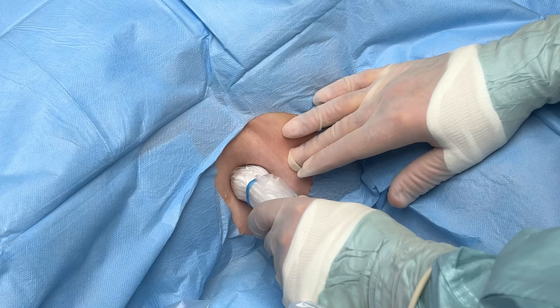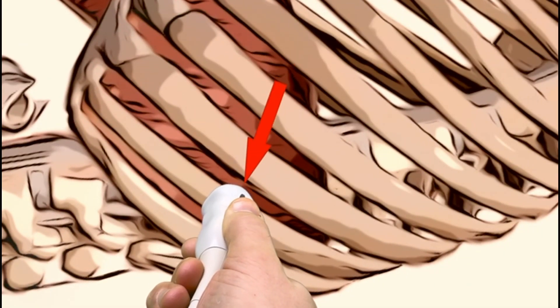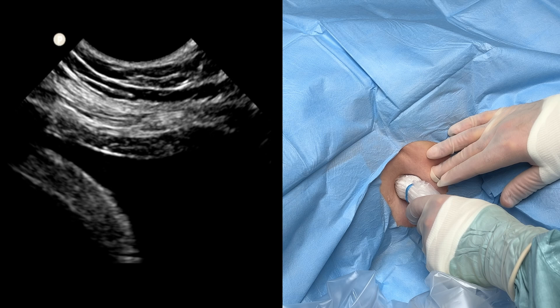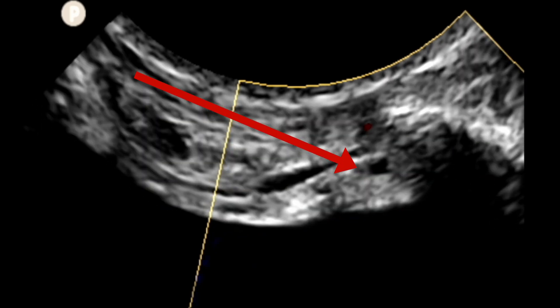Now place the probe where the diaphragm meets the thoracic wall and rotate the probe as demonstrated. As you'll be using the in-plane approach, this rotation results in a cannula path towards the patient's back. This leads the guide wire to the desired location, and where the guide wire goes, the drain will follow. Cannulation requires that you identify the following structures: the diaphragm, the pleural line, the lower and upper rib. These ribs present as hyperechoic lines with a black ultrasound shadow underneath. The neurovascular bundle is generally found just caudal to the upper rib. The artery can often, but not always, be visualized with color Doppler.